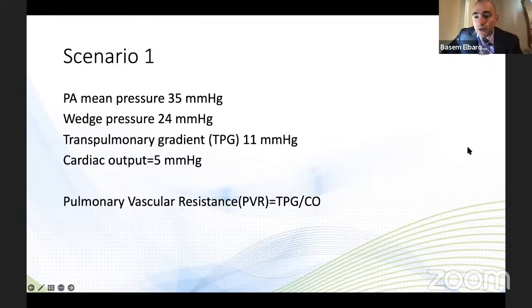بالنسبة للسؤال, Dr. Oakley, non-invasive hemodynamic assessment is an interesting field. It's not mainstream. There are new devices, NICAS, where you put electrodes on the patient and it will give you a cardiac output and SVR, or at least a cardiac output. And one of my colleagues is doing a research study. Every STEMI that comes into the cath lab, they'll use the device before and after the procedure and monitor their outcomes to see if it can help predict patient outcomes. But that's still in the research trial. So I don't think it's mainstream, at least that I'm aware of, that the non-invasive methods are being used.